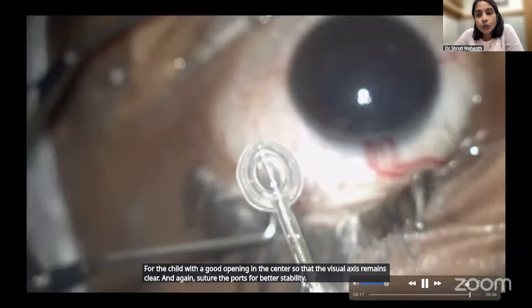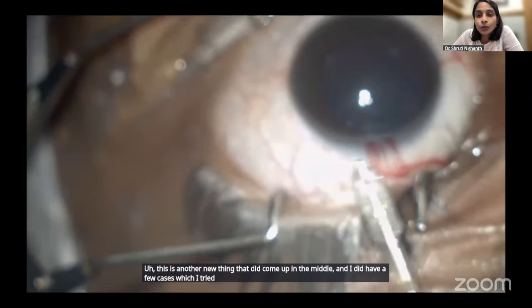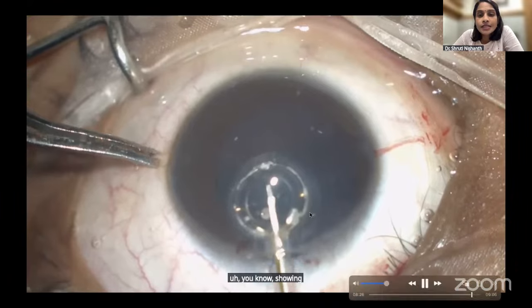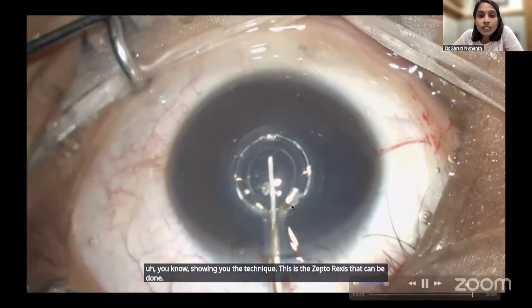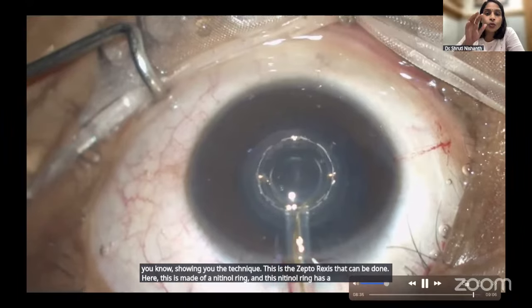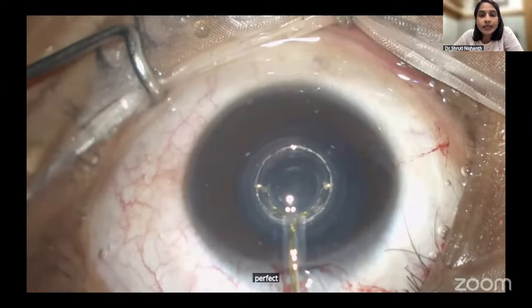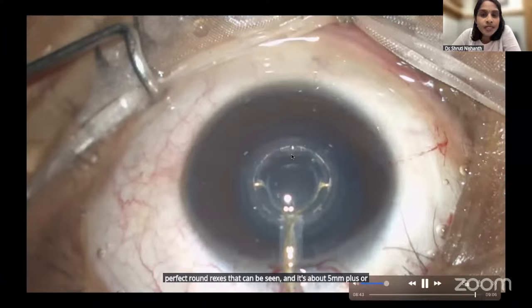This is another new thing that did come up in the middle, and I did have a few cases which I tried, and I don't do it anymore, but this is just for the interest of showing you the technique. This is the Zepto Rexis that can be done. Here, this is made of a nitinol ring, which is a collapsible ring. Once you put it on and press the suction, you get a perfectly round Rexis. It's about 5 mm plus or minus 0.2 mm. That's the size that you look at.